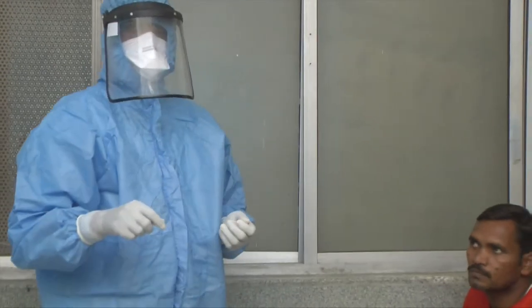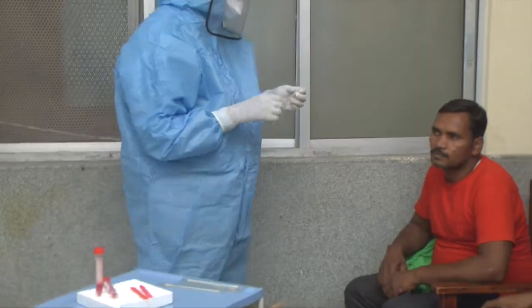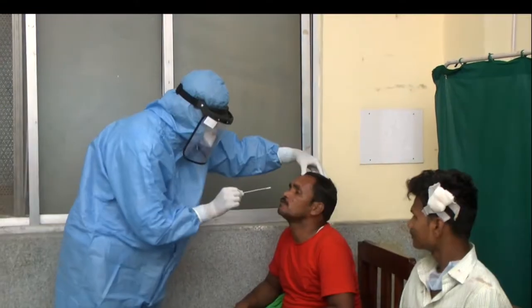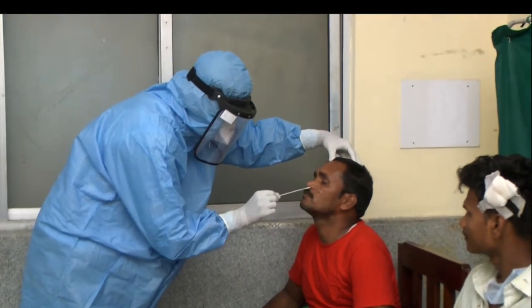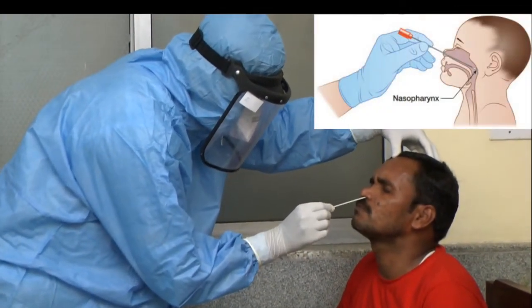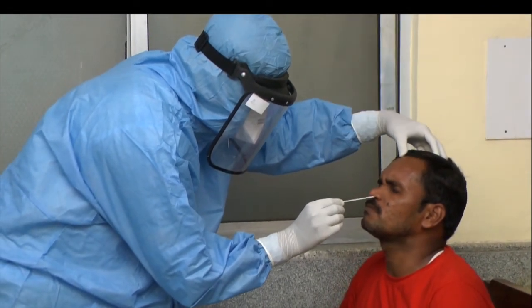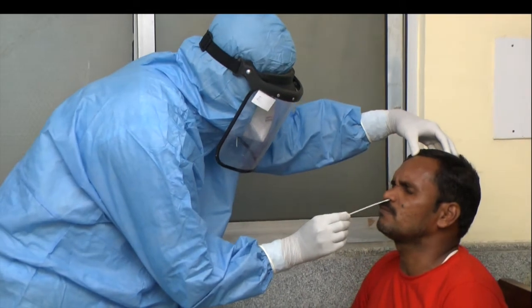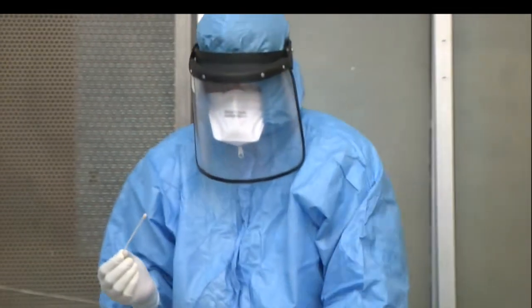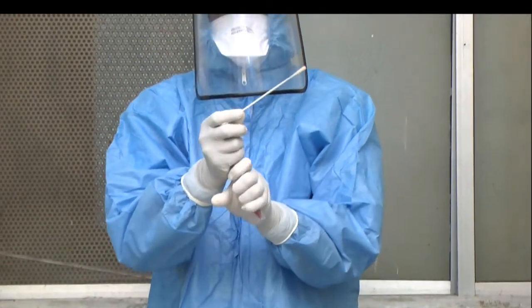Now I am going to demonstrate how to take a nasopharyngeal swab. Tilt the patient's head slightly backwards. Insert the swab stick horizontally. The approximate distance is equal to the distance between the tragus and the anterior nares. Once collected, cut the swab stick and place it in the viral transport medium.